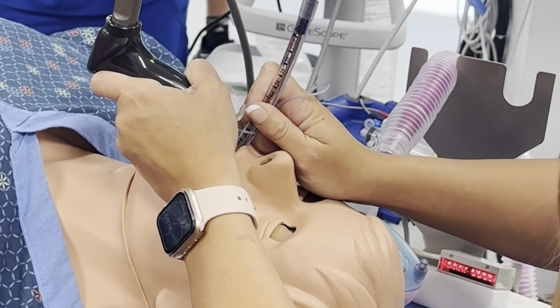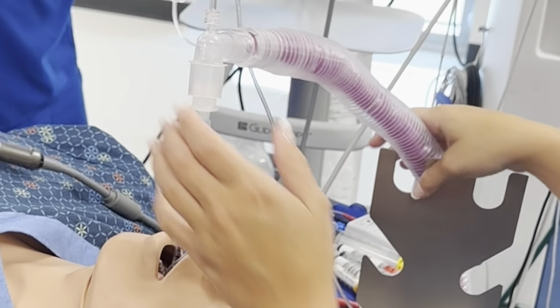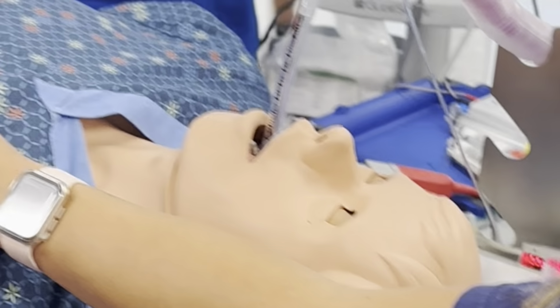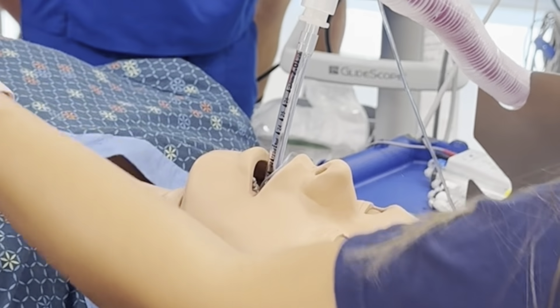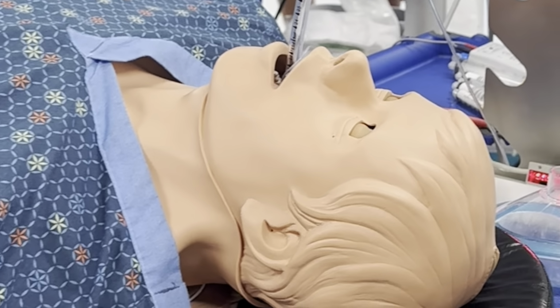Now we're gonna ask to pull the stylet, and we'll advance slightly more. So we're gonna inflate the cuff on the endotracheal tube, and then we're gonna make sure that we're in the right spot. So we're gonna give a few breaths while we listen to the breath sounds. We're gonna make sure that the breath sounds are bilateral and equal, and that we don't hear anything in the stomach, because you don't want the tube in the stomach. Look, we're getting end tidal now too. See that we got the waveform back? So now we are breathing for the patient.